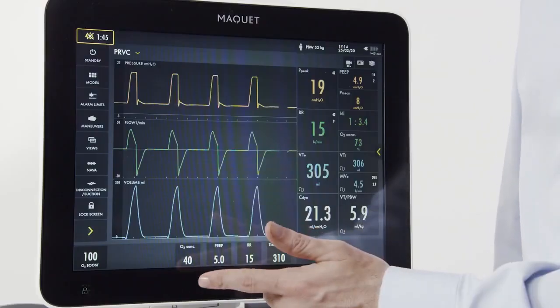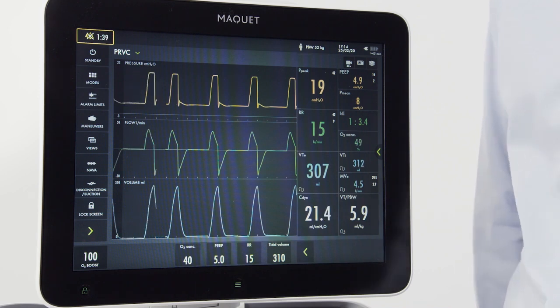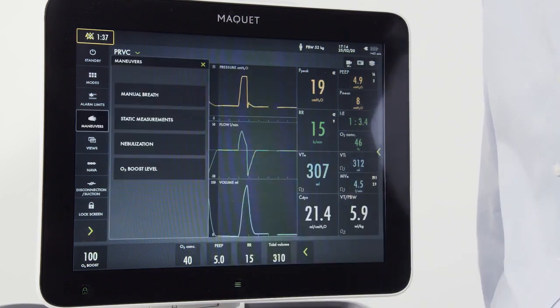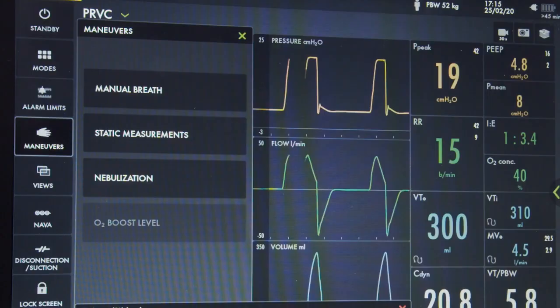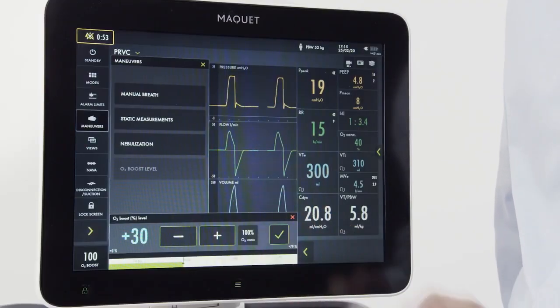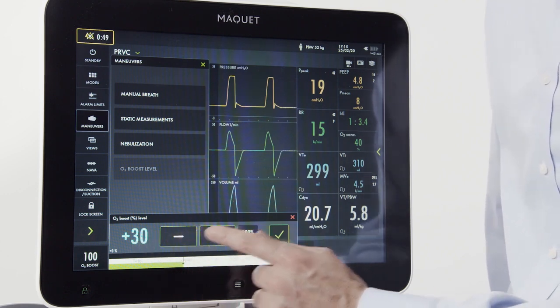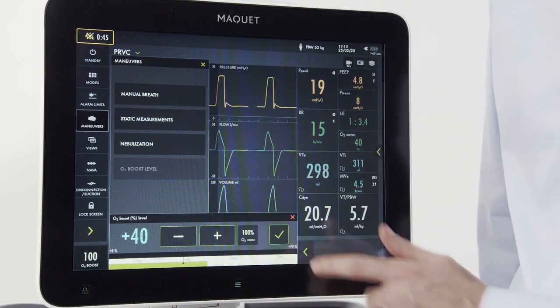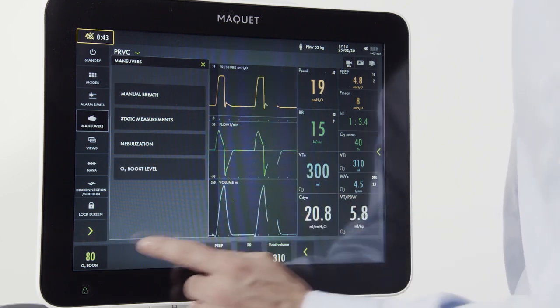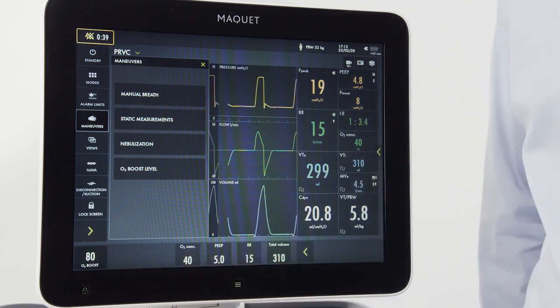The O2 boost in this instance was set to deliver 100%. If I want to adjust that to an incremental increase, I can easily do that by going to the maneuver screen. I press my O2 boost level button, then press the 100% — now my O2 percentage has lit up and I can adjust the desired level for oxygen increase. The oxygen boost level will be displayed on the screen at all times.